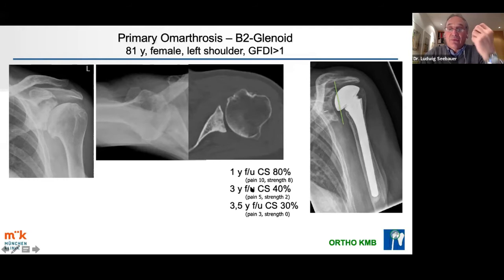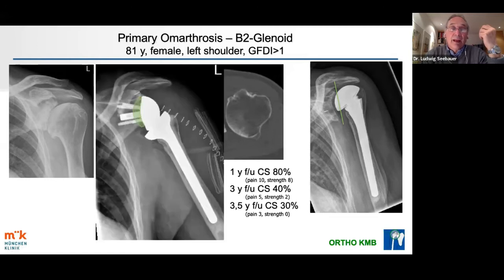She decreased after 3 years dramatically. And then I have to revise her. And what I have to do at my revision, I have to do a bone graft to address the bone loss, which I initially missed or did not take serious enough.